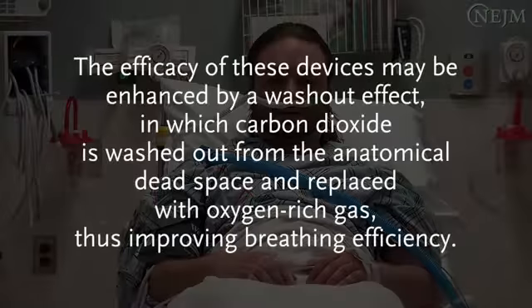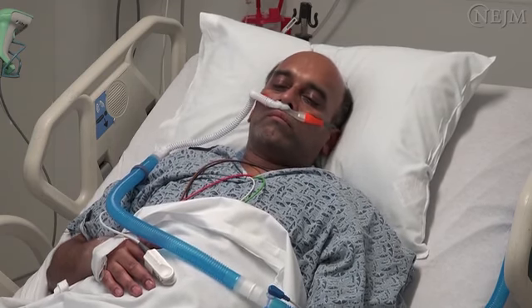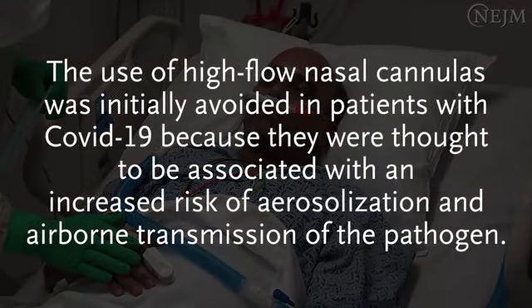The efficacy of these devices may be enhanced by a washout effect in which carbon dioxide is washed out from the anatomical dead space and replaced with oxygen-rich gas, thus improving breathing efficiency. In addition, the administration of supplemental oxygen through a high-flow nasal cannula can reduce the need for endotracheal intubation and mechanical ventilation.